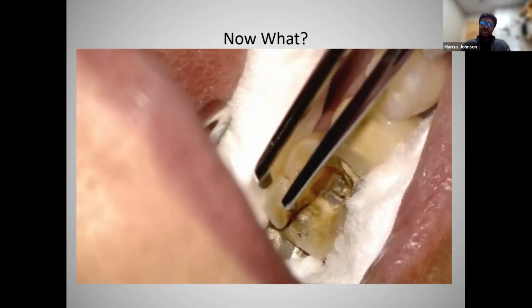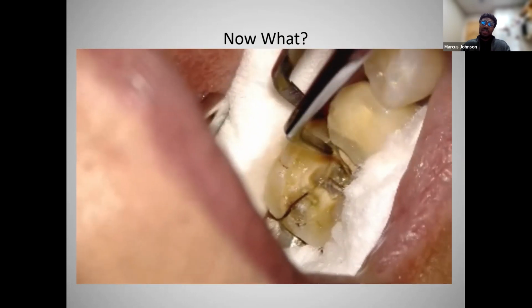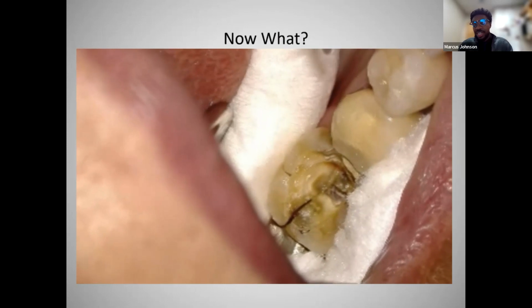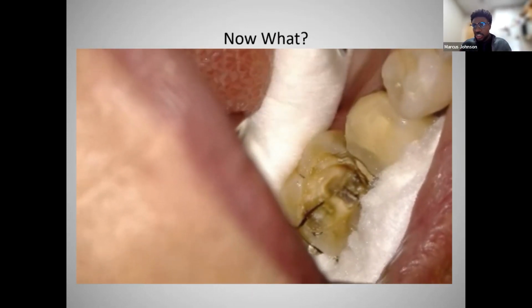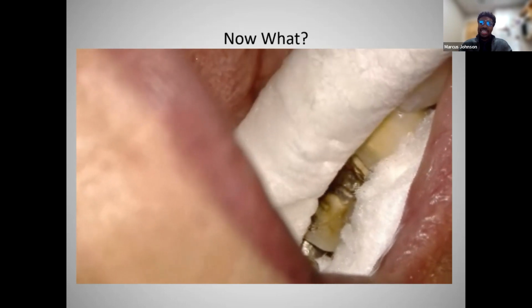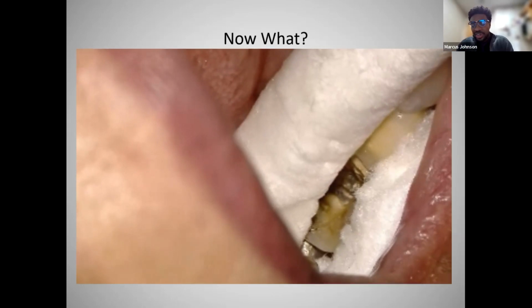Without a doubt, you can see that the lingual aspect is mobile. This tooth has to go. It's a cash paying patient, and we're not going to have a real discussion about value, but nonetheless, I wanted to keep my integrity for the sake of the patient and also honor the referral. So we worked out something that was fair, and we were both equally happy.